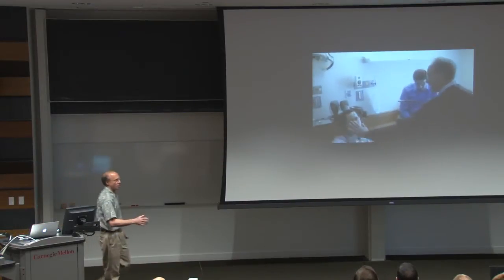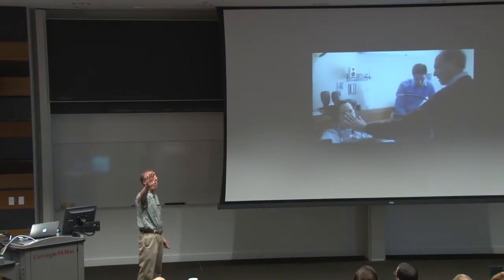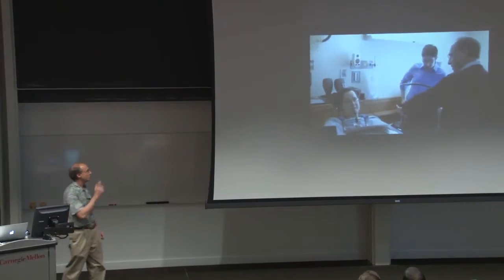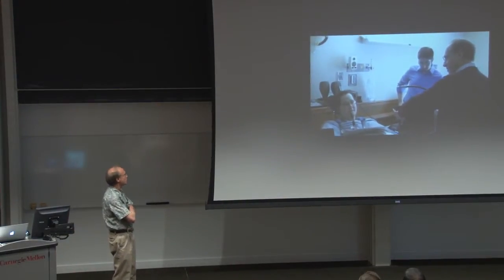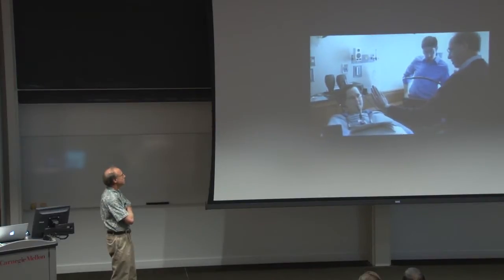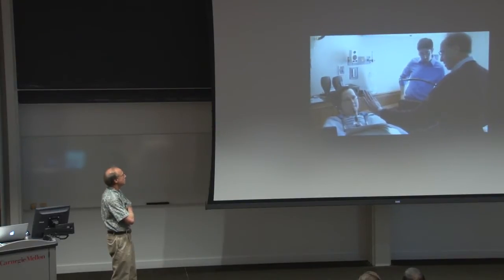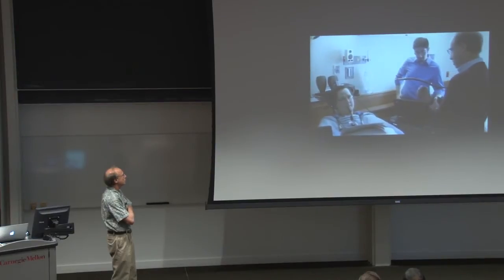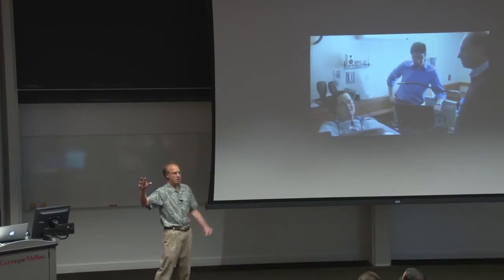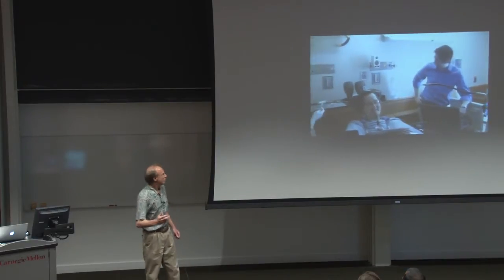So we don't have any fancy equipment. I just said, hey, think about moving your hand to my hand. And while she does that, I don't know if you'll be able to hear it, we recorded a single unit, although we had 200 we could choose from. So just have her thinking about moving her hand. So you could hear this neuron fire when she thought about moving her wrist. This was on the lateral array in the wrist and hand area. So it was pretty nice.